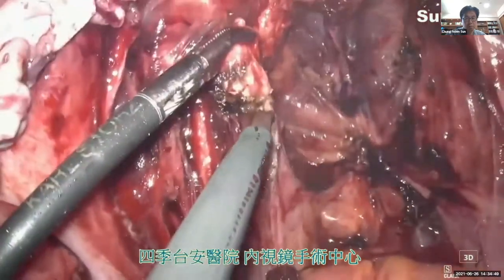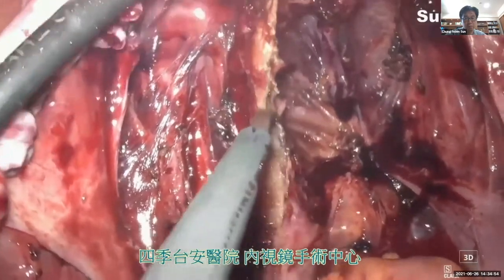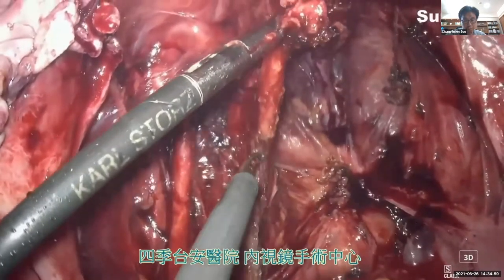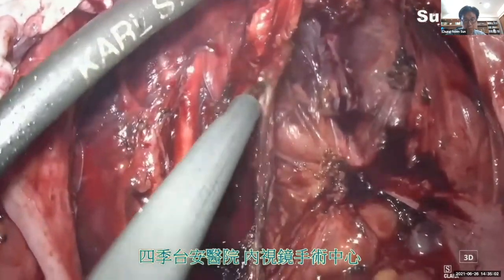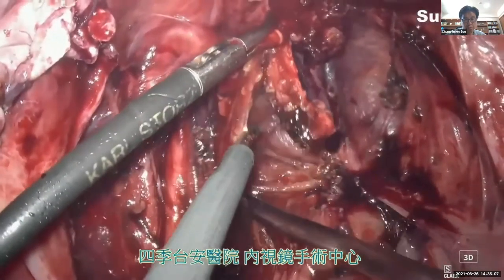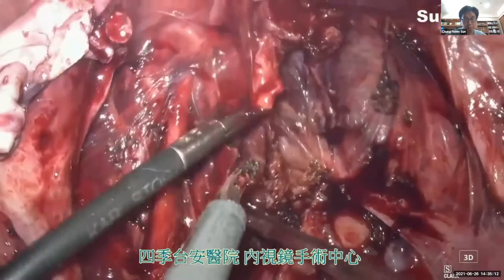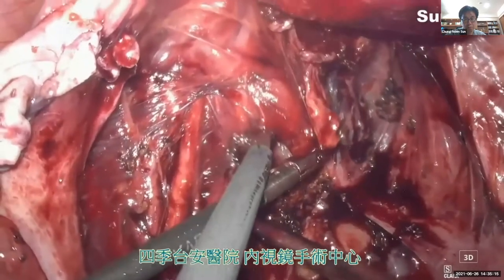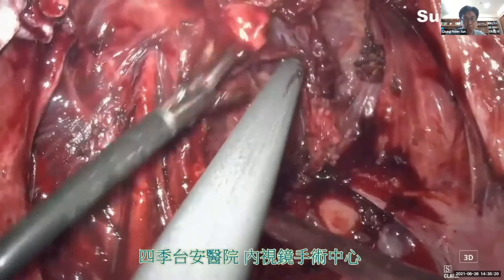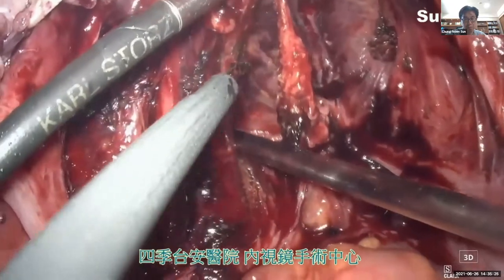I like to use monopolar energy. You can see my left hand keeps the tissue tension. My assistant also helps me to keep the tissue on tension. So when I apply the unipolar energy and I'm cutting very precisely just between the normal tissue and the fibrotic tissue, I can easily separate the fibrotic tissue away from the normal tissues, like this.